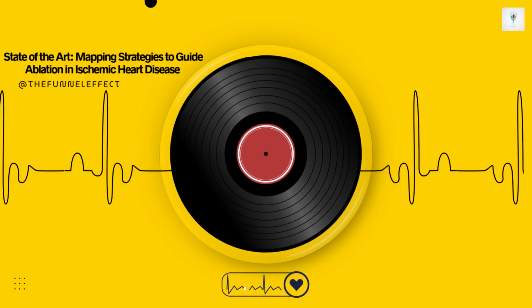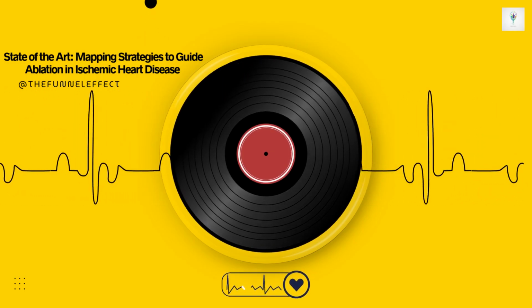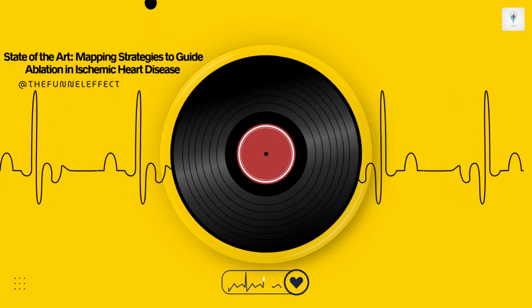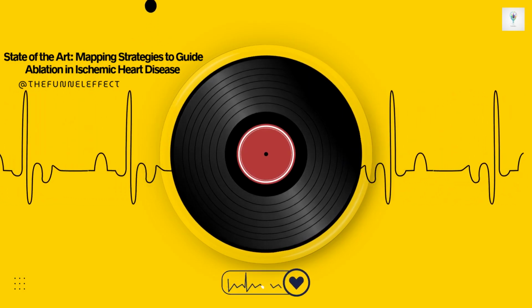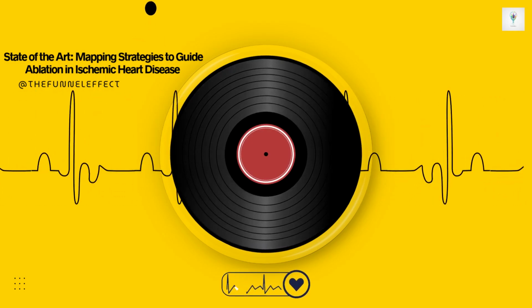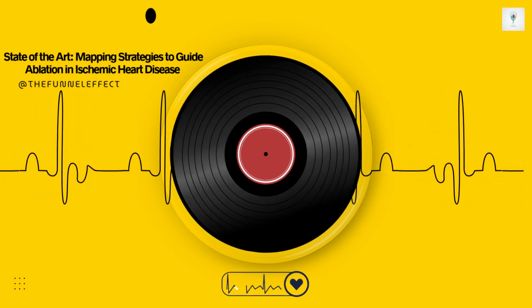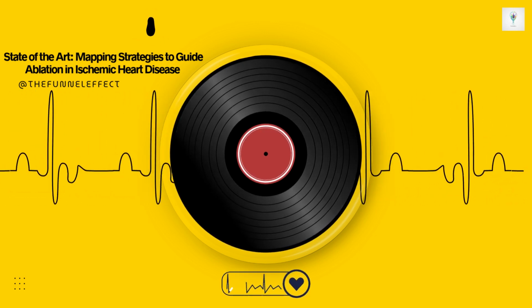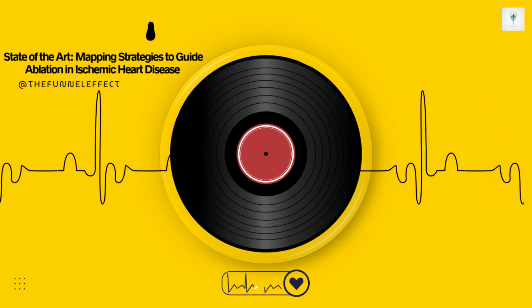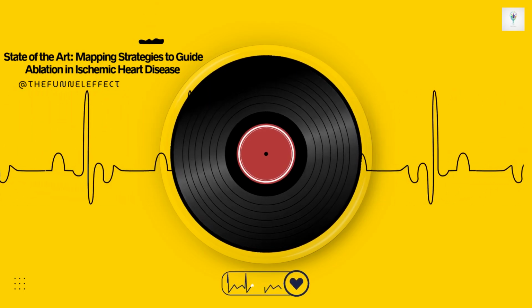The first spike, the biggest spike, the latest one. And picking the wrong one messes up the whole map. Completely. If you consistently misidentify the local activation time, the resulting activation map will look chaotic, maybe showing multiple simultaneous wavefronts or patterns that don't make physiological sense. It won't show that clear circulating pattern you're looking for. Okay, so if you manage to annotate the timing correctly and the map looks plausible, what's the key visual feature that tells you you're likely looking at the isthmus itself?